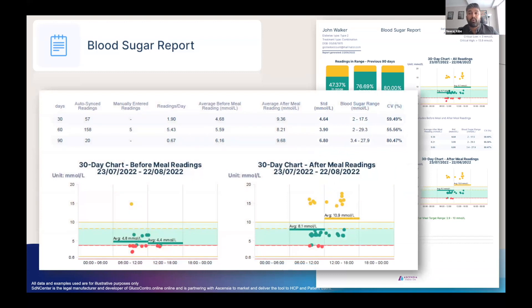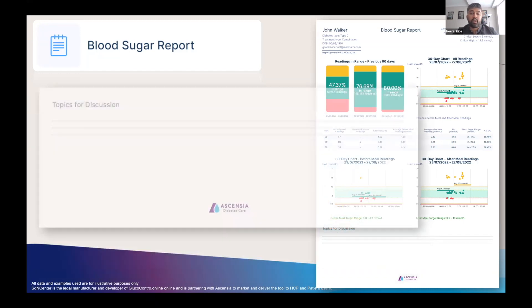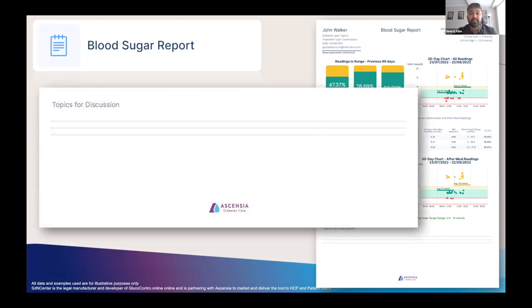The second half of the report focuses on just the last 30 days, and the two graphs plot readings across the 24 hours of the day for both before and after meal readings. At the bottom of the page is a space to write any topics for discussion, which if printed out is a great place to capture key observations or agreed actions for your patients to take away with them.